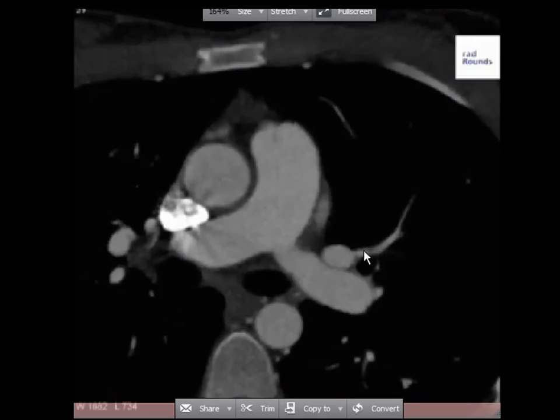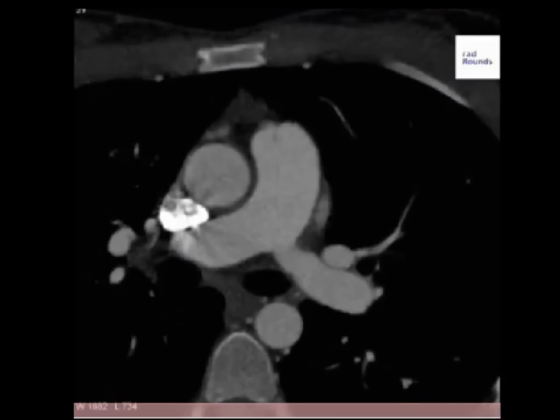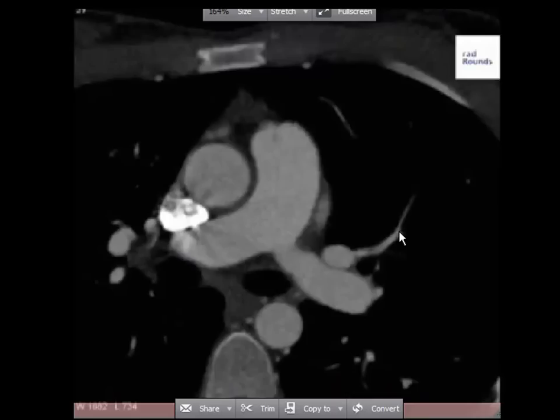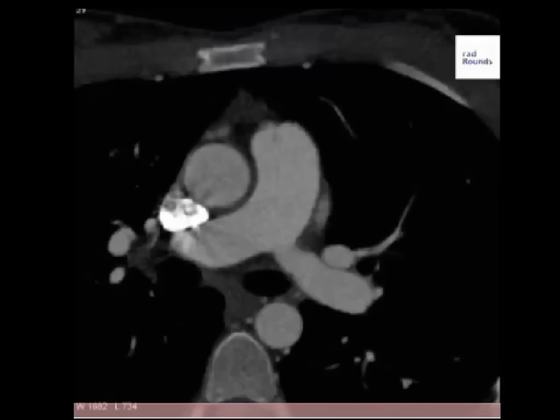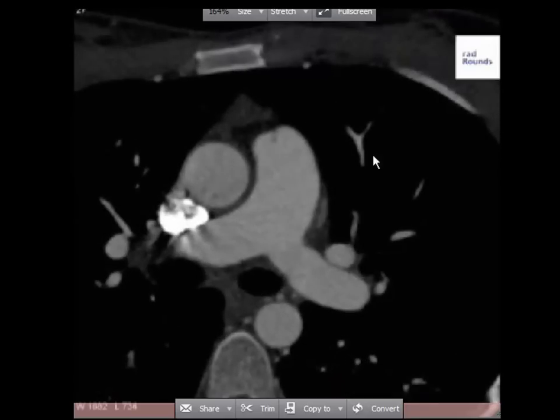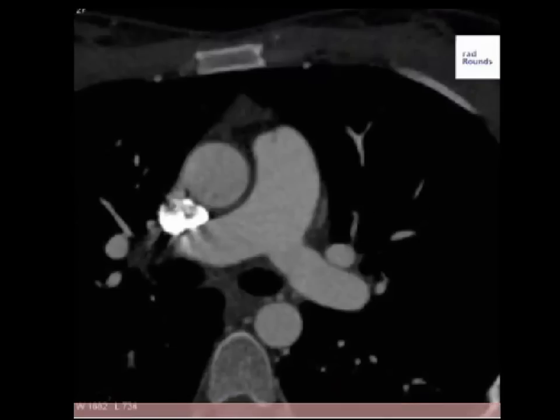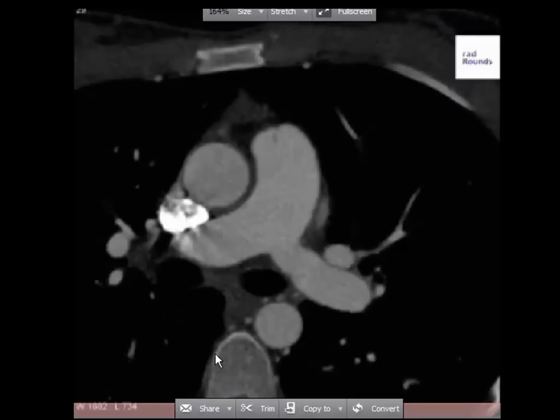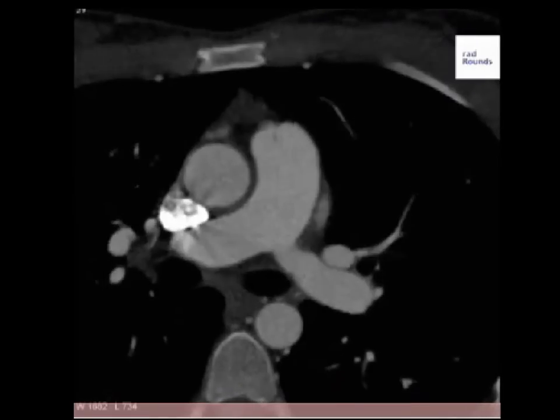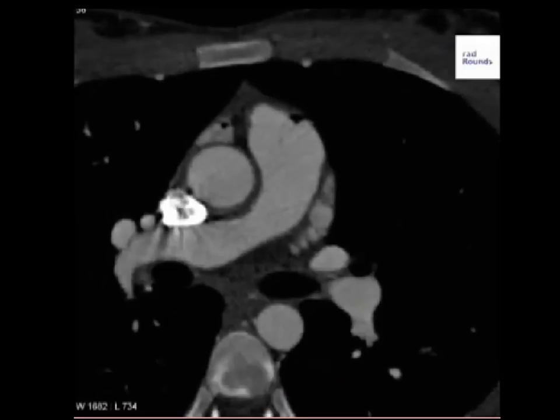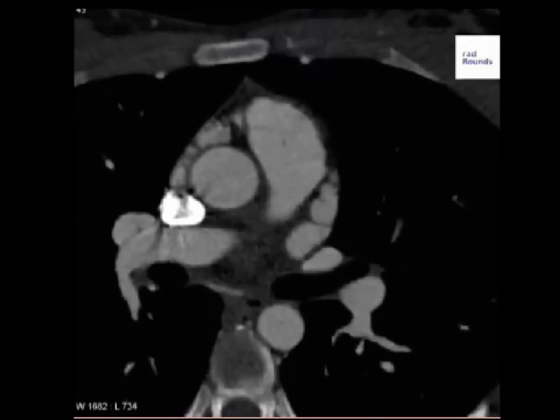Now there's another blood vessel here and we want to know whether this is a branch of the pulmonary artery or whether it contributes to the pulmonary venous system. So we'll follow this up and down. There's a branch coming from here and another branch here. Going down inferiorly, we can see that both vessels are joining here — and this is the blood vessel that we're tracing.